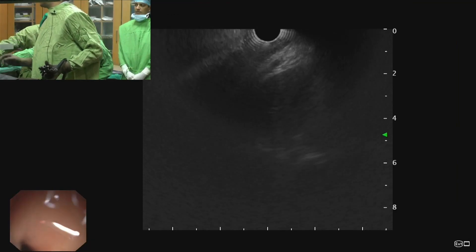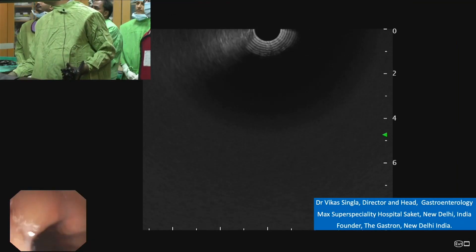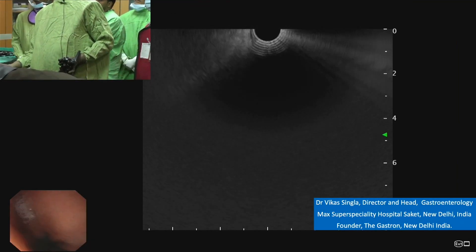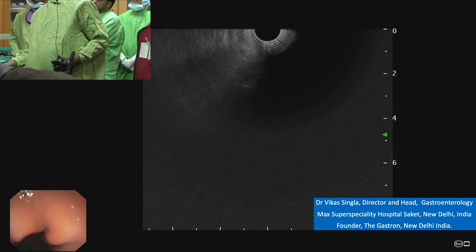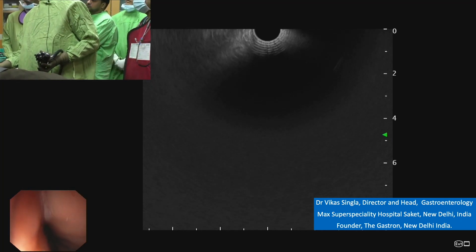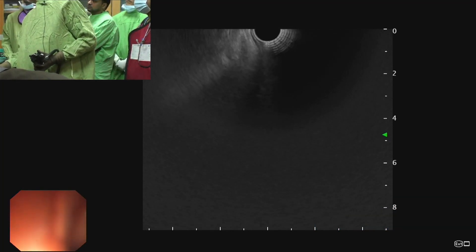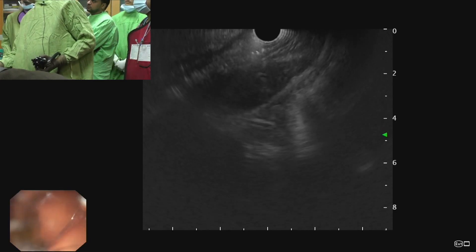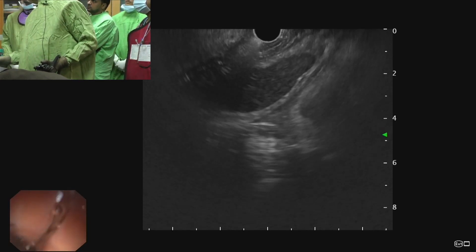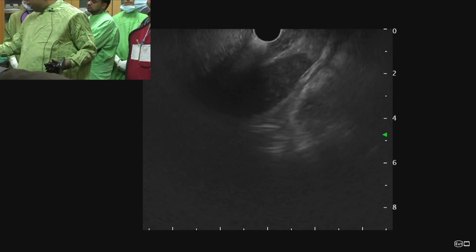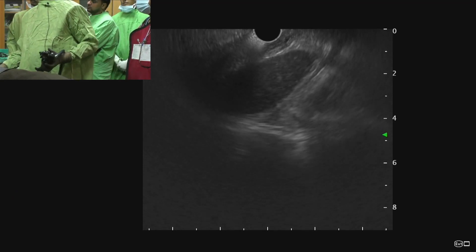The CBD can be seen from three areas: one is the proximal stomach, second is the first part of duodenum, and third is the second part of duodenum. First, we will see from the stomach.